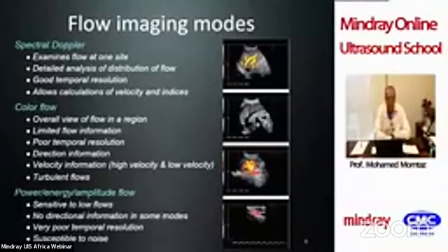And you can see turbulent flow, as you will see in the ductus venosus. When you detect the ductus venosus from the color, you will find turbulence. You will find many colors at the same point.